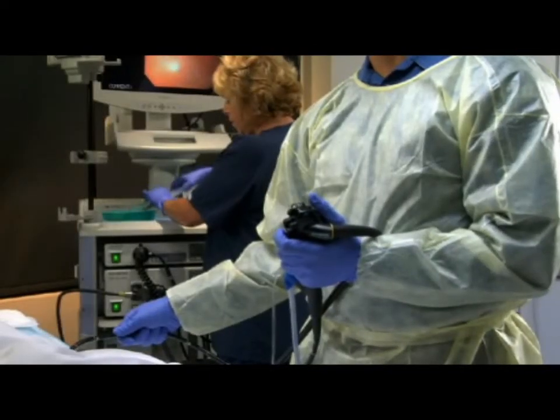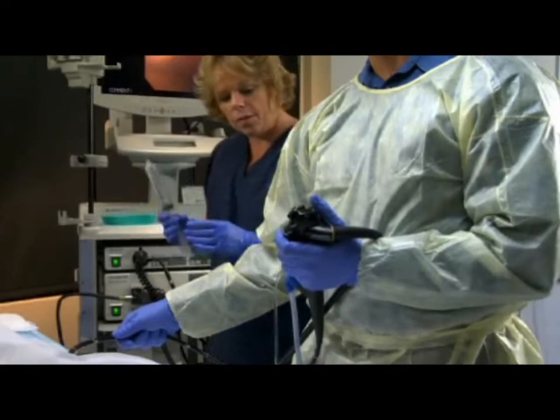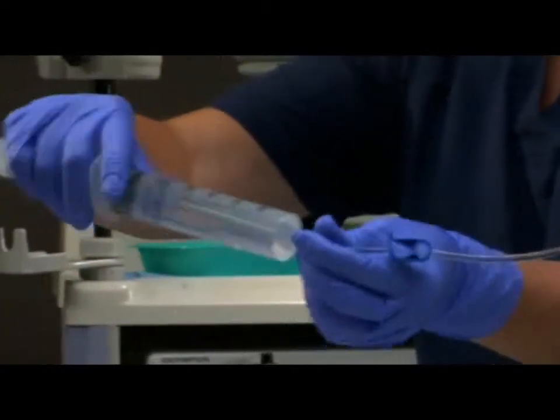If irrigation is needed for the procedure, there are two options. Option number one, connect the irrigation line to a 60 cc syringe.